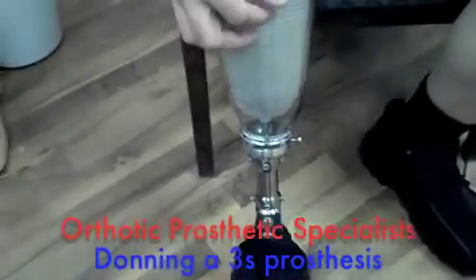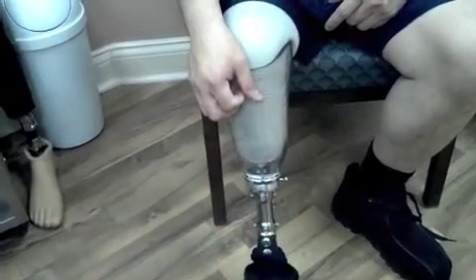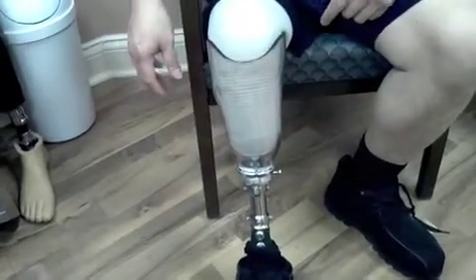You should have at least 2 to 3 clicks before walking is safe. This can be achieved by either pulling the socket onto the leg with hands.